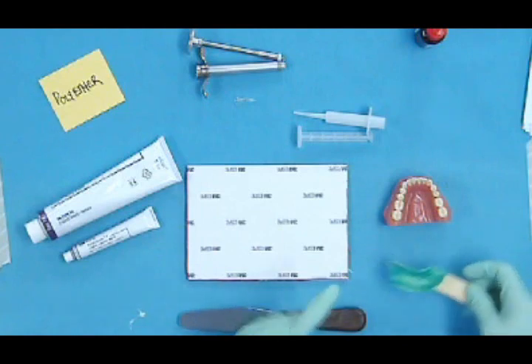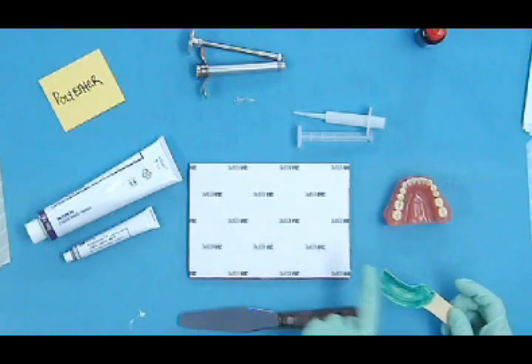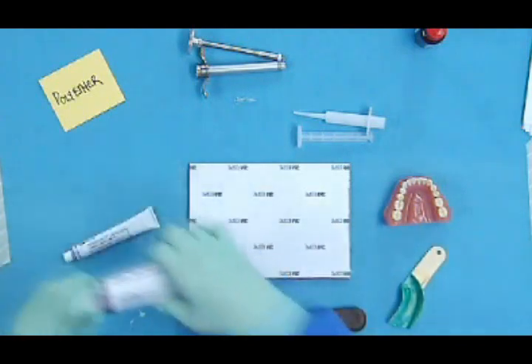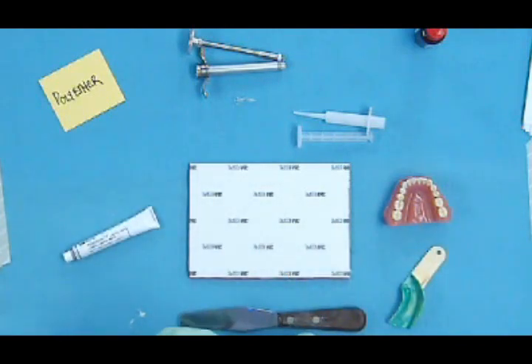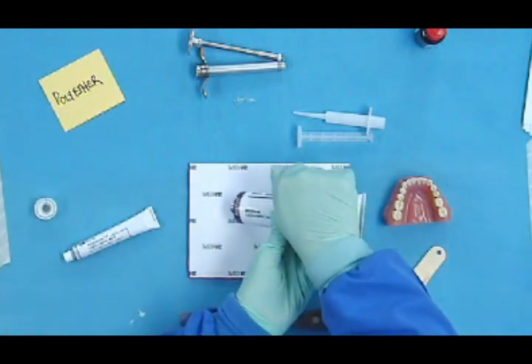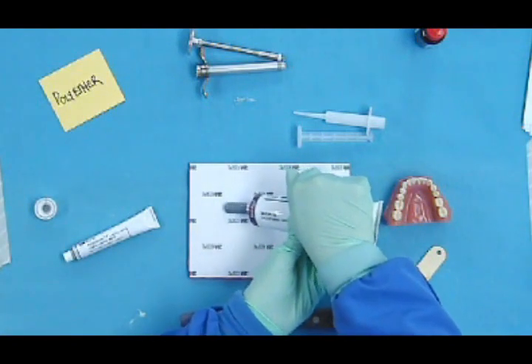So I want enough impression material on my pad to fill this tray and also put some in the syringe. So I will measure out equal lengths of base. This is the base.